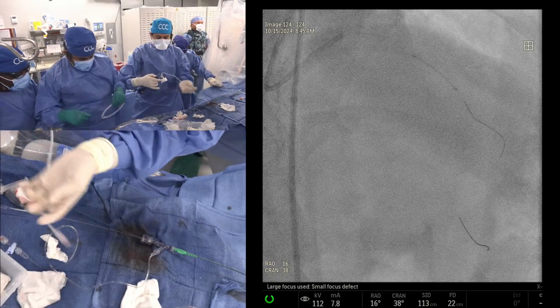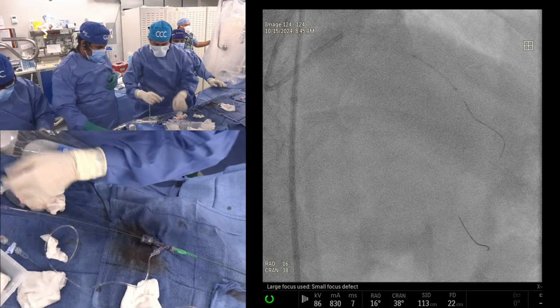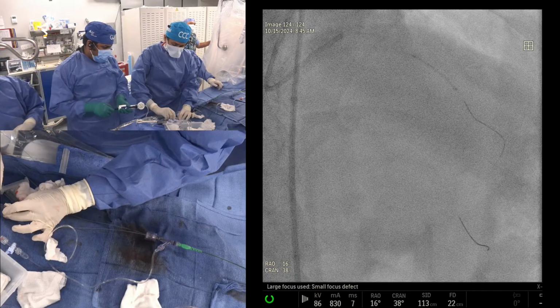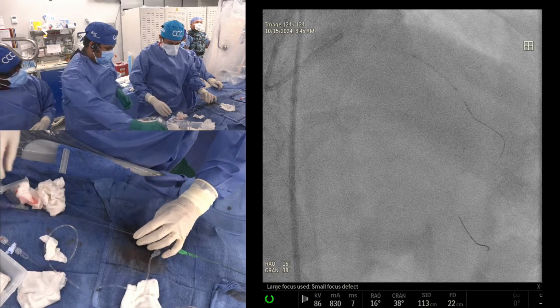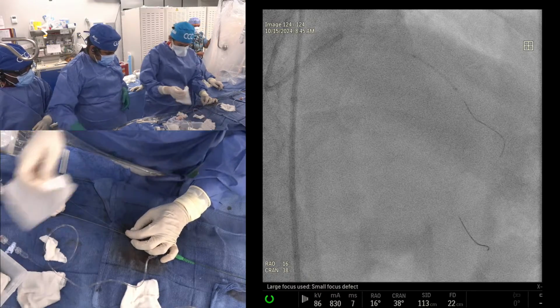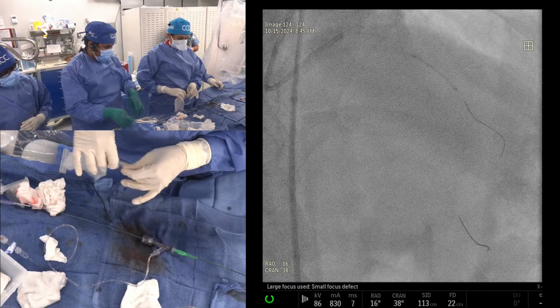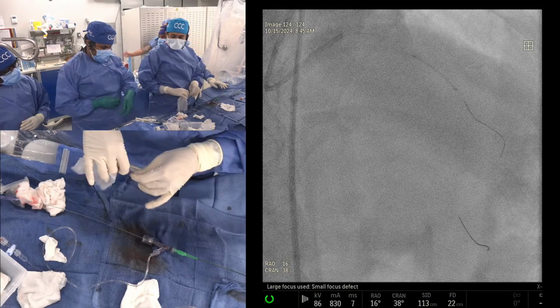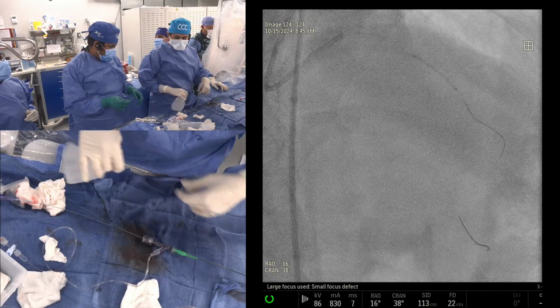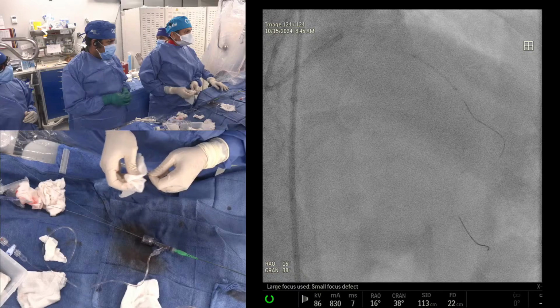And where is Andrew? Can he show step crush? Yeah, if he's still there. So, people watch this so carefully. This is Nikhil Jha, who I have always recognized for making very good observations. He says on the app, the mini crush is suggesting 7 French. That is correct. Yes. Very observant. So I can tell you the mini crush with only 6 French is only Sharma. Even the company does not promote it. The company has not done it.